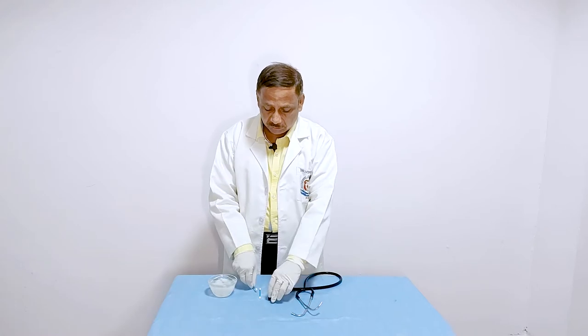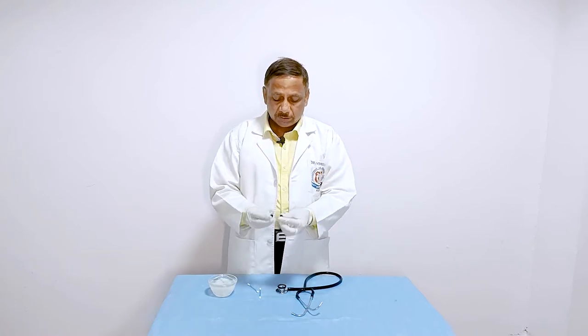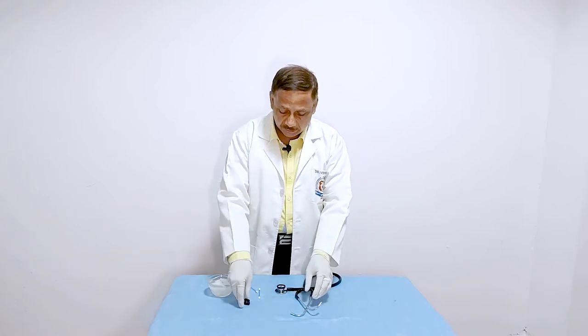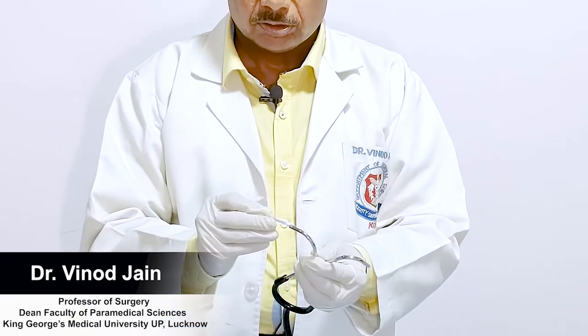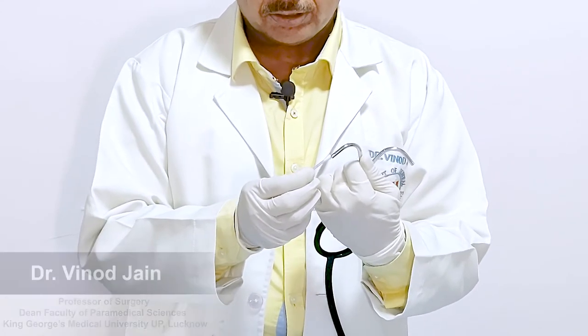After you have cleaned the earpieces separately, now you need to clean the inner side of the stethoscope where the earbud is applied.